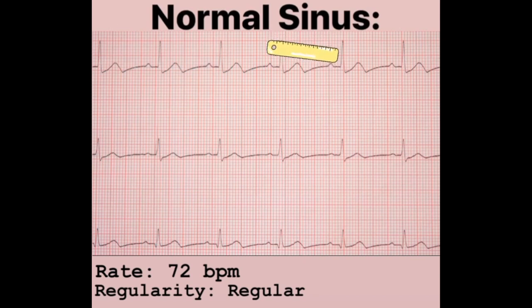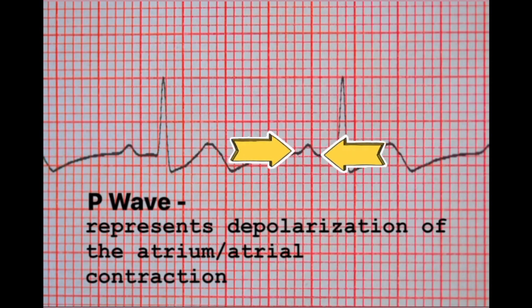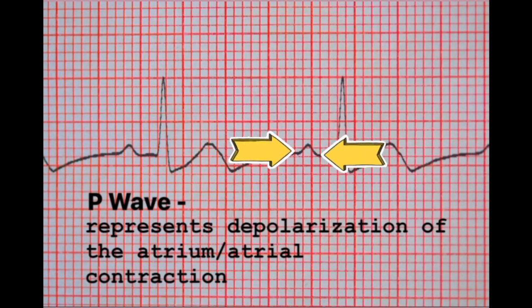The next thing we need to check is our P waves. Our P waves — upright and present. They appear to be on this EKG strip. Taking a closer look, you can see that the P wave is there — it is present and it is upright. The P wave represents the depolarization of the atrium, or the atrial contraction. The atrium is on top of the ventricles and is smaller than the ventricles. So when you're looking at the P wave on the EKG strip, it's going to be a smaller wave in comparison to the ventricles contracting.